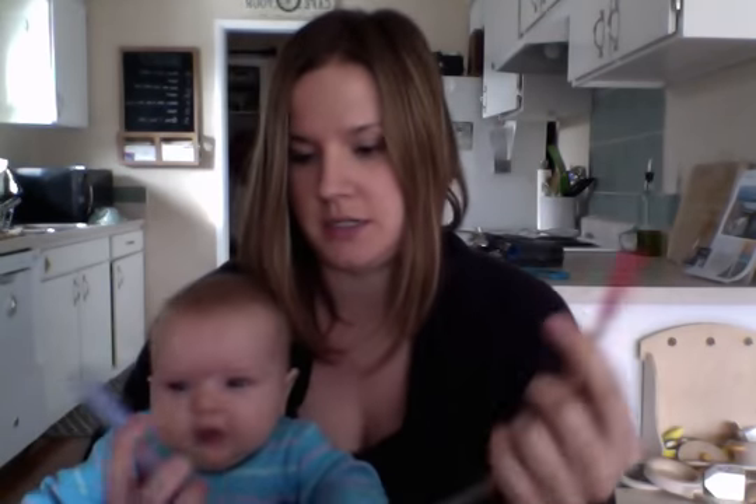I got this one at Target, but I think you can find them other places easily. It was $15.99. Basically it is a little tube here, and then you suck on this part, and then you put that part in their nose and suck.